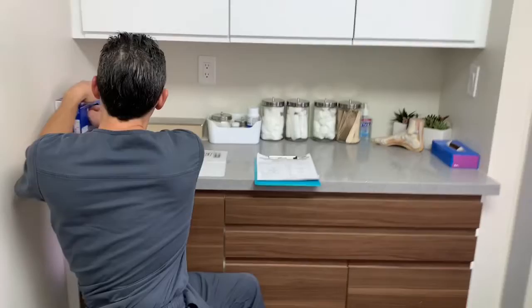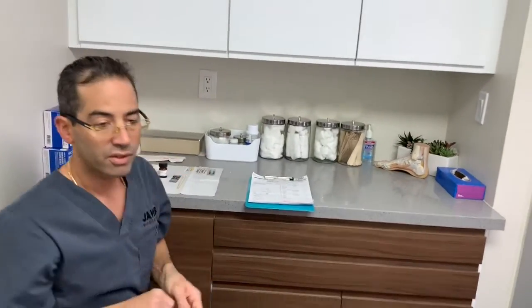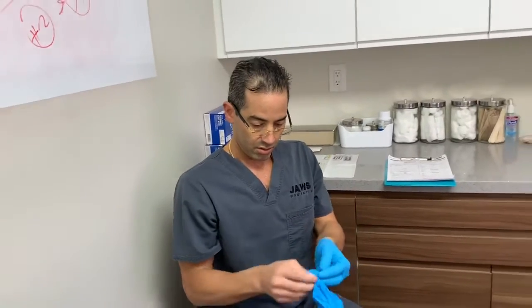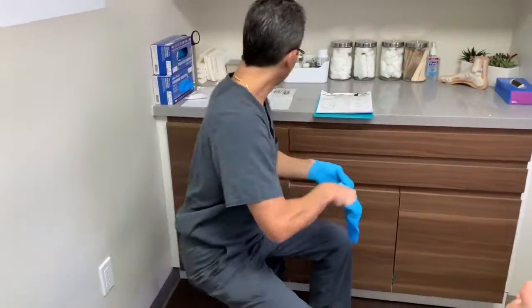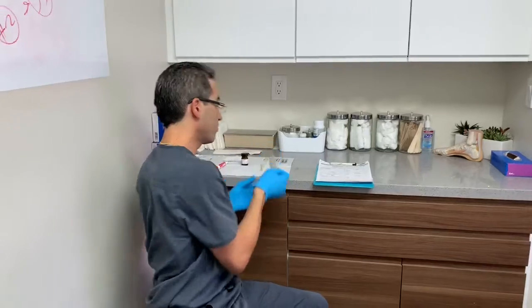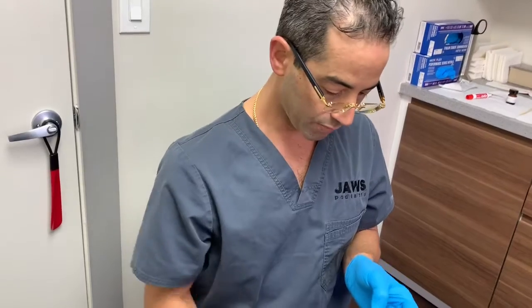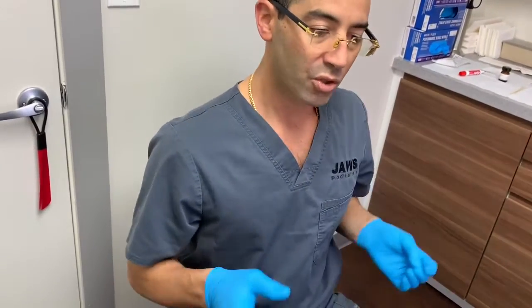The first thing that we're going to do is trim the callus, okay? And this is a great case for a lot of reasons. And again, this is not going to hurt. With kids, everyone knows that I love kids and I love treating kids. I'd like to be very, very clear, even when they see a little blade. The only thing I ask from the kids is just to please not move. That's all. And if they feel any discomfort, they'll let me know.